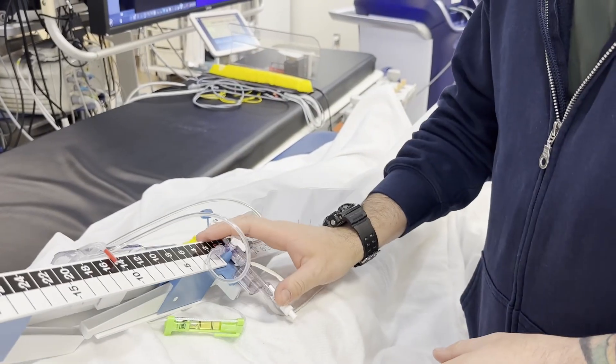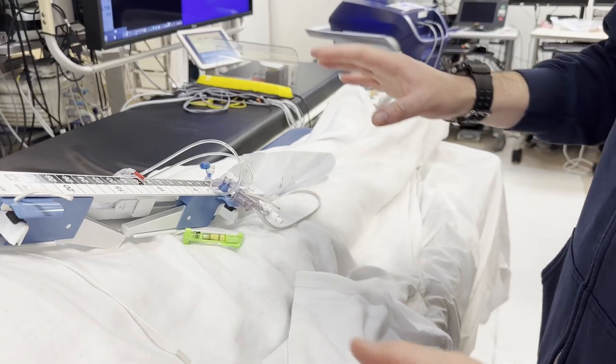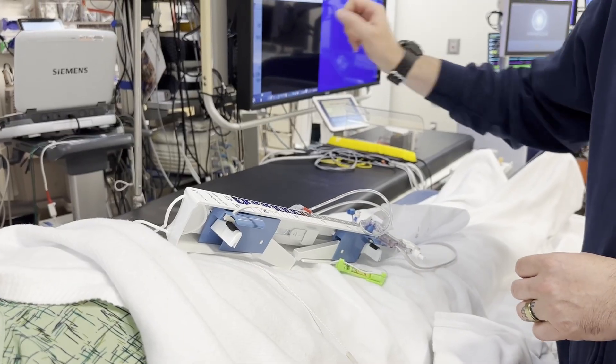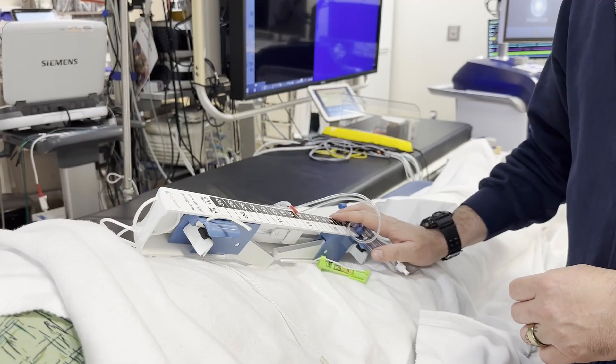Today we're going to be talking about EVDs in the cath lab. We're going to talk about transferring the patient safely to the bed, setting up the EVD drain to the pole on the cath lab table, and zeroing.